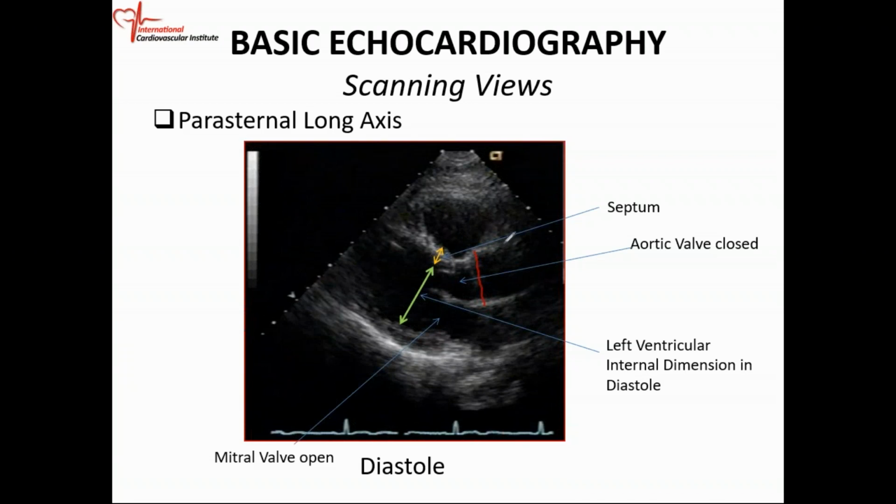That is where the ascending aorta meets the sinus. You have to say where you're measuring it because the measurement differs. So this is your aortic root right there.